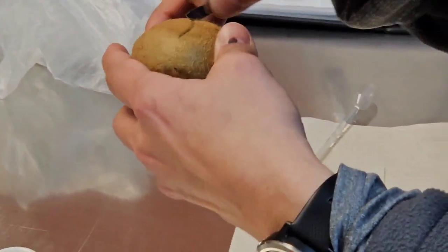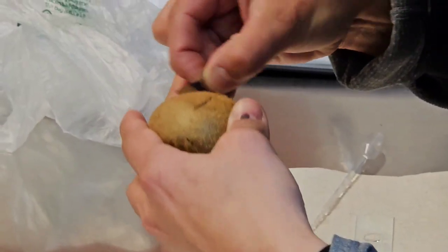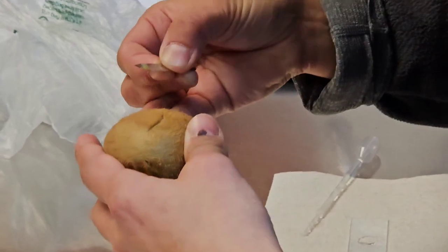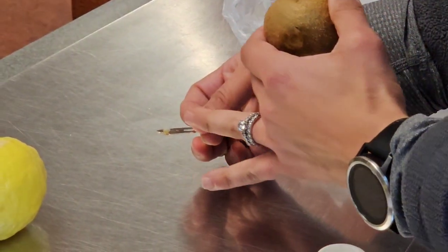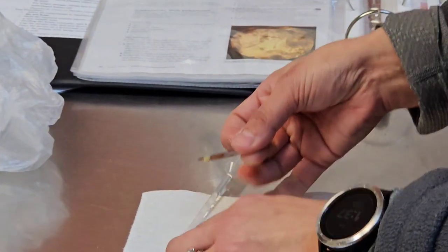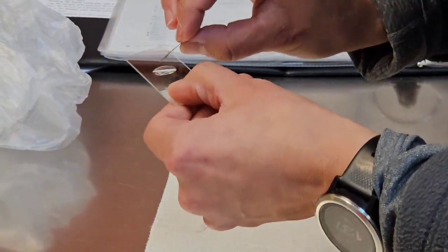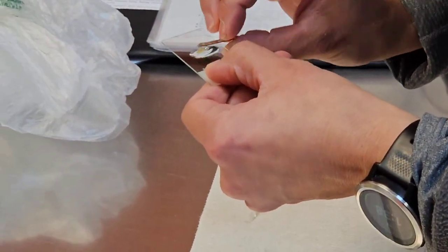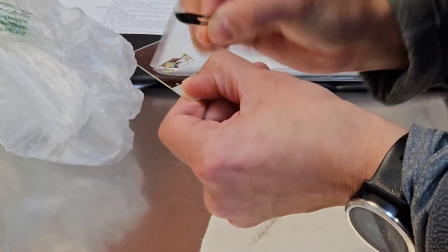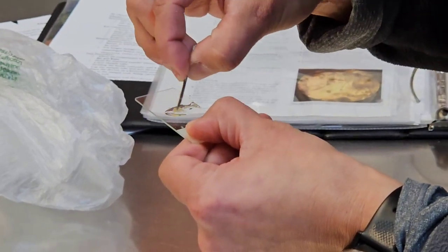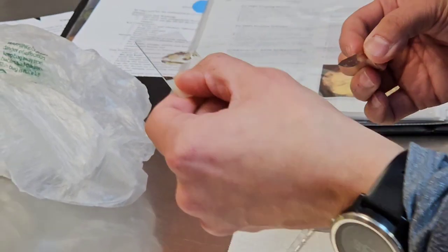Actually, I see nothing on that blade. But you'll start to see some of the skin and hair come on your blade, and you'll want to rub it in the mineral oil, scrape it along the side, and get your sample in the mineral oil like that, and that's it.